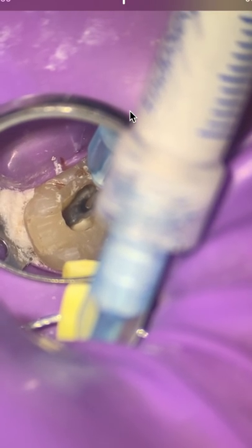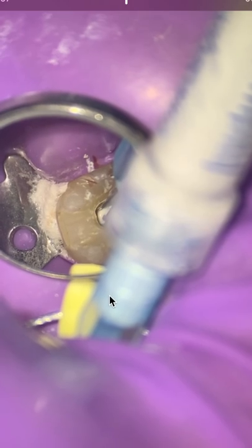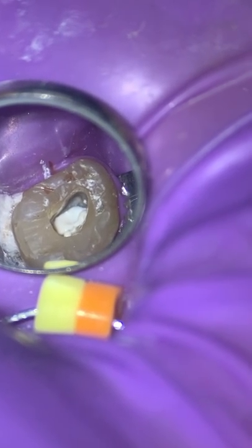So we'll place our BC sealer. I'm now using just an acid etch tip. It's just easier to find. They're always in the drawer. And they save more BC sealer, so you don't have to waste so much in those big tips that I've been using for the last, like, half a decade.